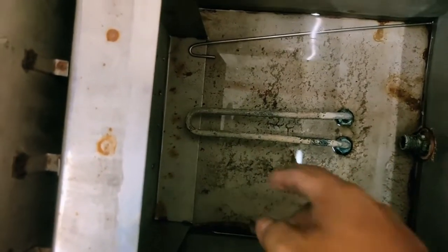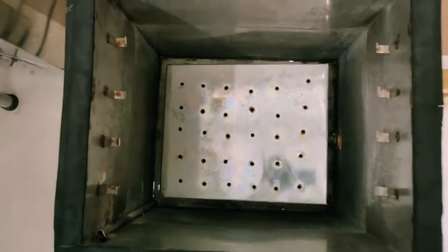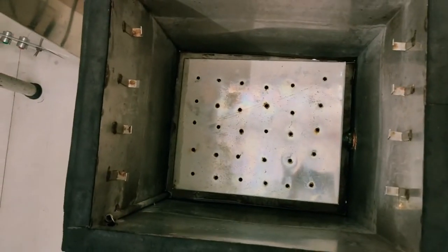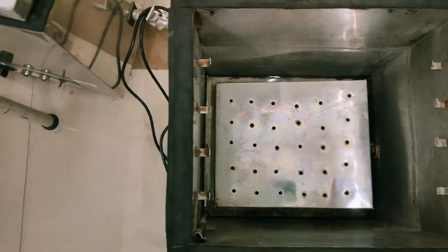This coil gets heated up whenever you switch on the machine, and due to this the water boils. We can maintain the temperature of the water between 70 to 75 degrees Celsius.